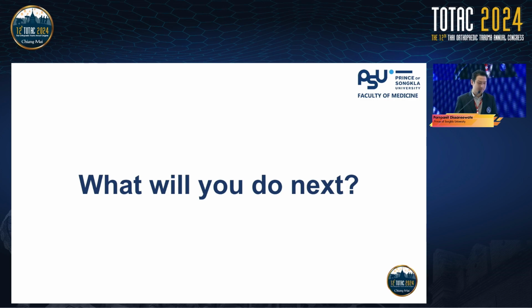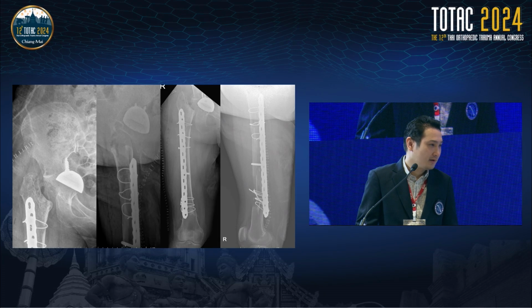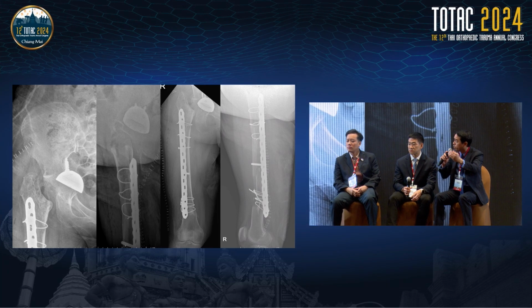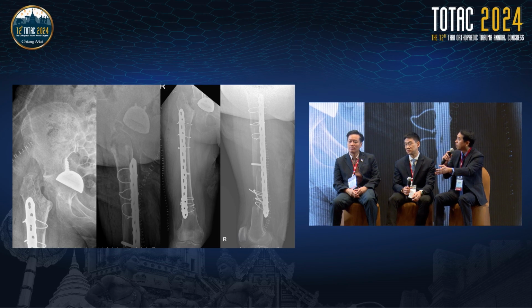I have a question. She has had pain for a year, right? Yes. And what about the histology from the first operation regarding infection? No history of infection. Did they send for histology? Yes, confirmed that there is no evidence of infection. I see the cup looks quite protrusive inside. Yes. Did that happen during the total hip replacement, or was it already protrusive with the bipolar? I'm not sure because I don't have the first X-ray of the patient. So let's say that the acetabulum fracture is new, right? Maybe it's new.